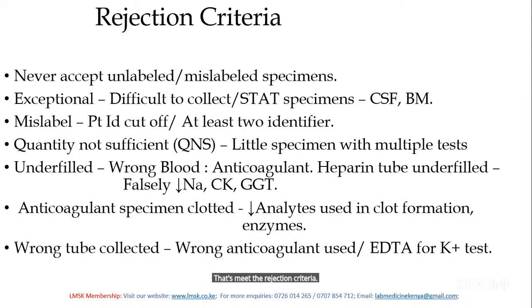When the tube has been underfilled, that meets the criteria, because an underfilled tube will have a wrong blood to anticoagulant ratio.